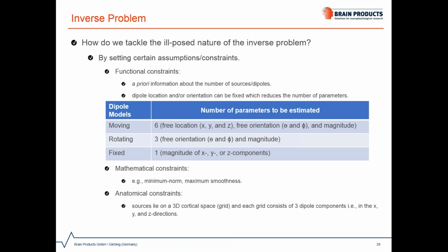Just to add a word of caution here, when combining prior knowledge with that of the voltage data, care must be taken not to give too much emphasis on the prior knowledge, as the inferred solution will correspond exactly as expected. For example, when you prepare a chicken soup, you add salt to bring out the flavor in the broth, just as prior knowledge should be used to enhance the information content of the data. But adding too much salt, however, makes your soup taste like salt, destroying the flavor. So there should be a balance between the model data and the real data.